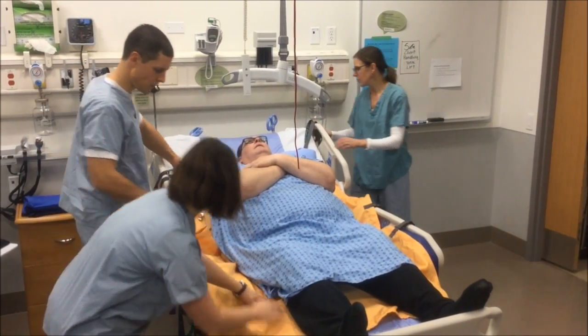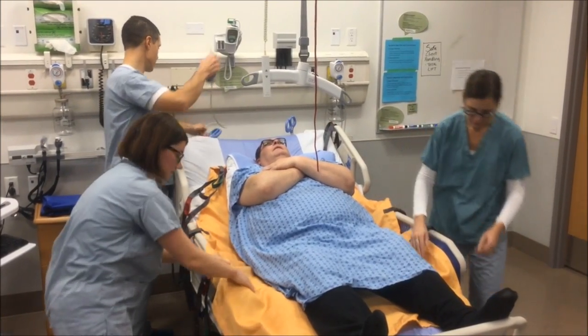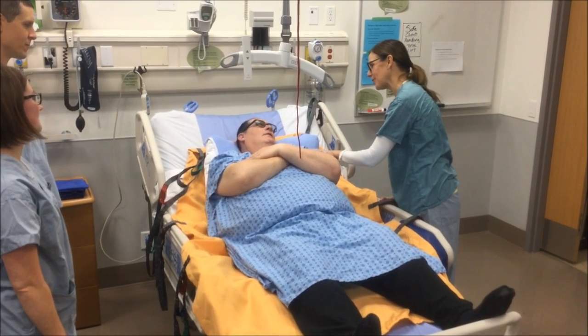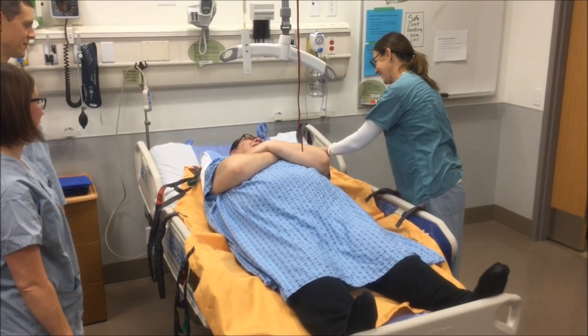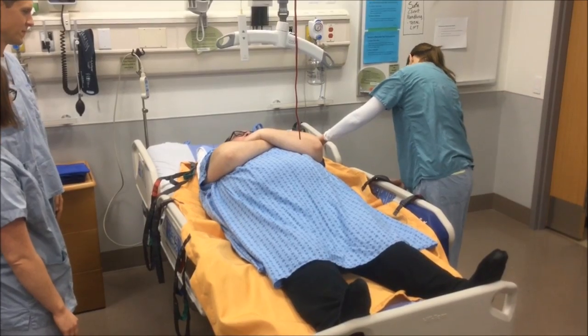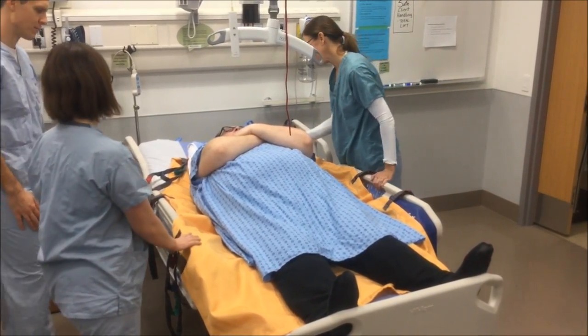Prior to moving the client, check that there are no foreign objects that could become trapped under the client and or within skin folds. For repositioning and log rolling, it is best to have the bed in a flat position. However, clients with obesity may have difficulty breathing in this position due to pressure on the diaphragm and may require the head of the bed to be raised. The client in this video does not have difficulties with lying flat.